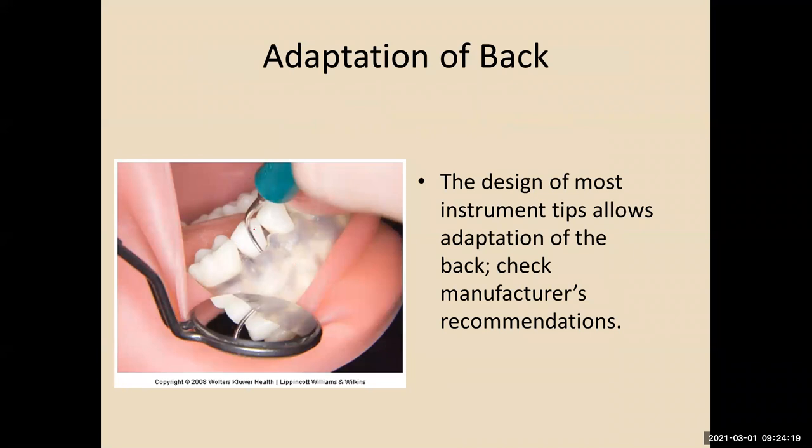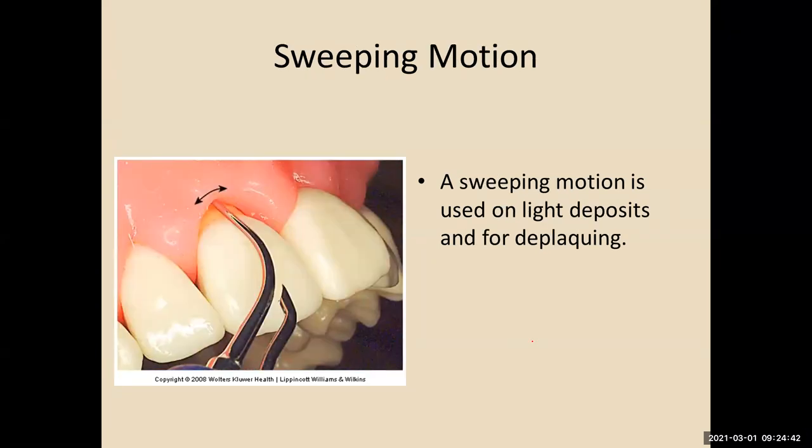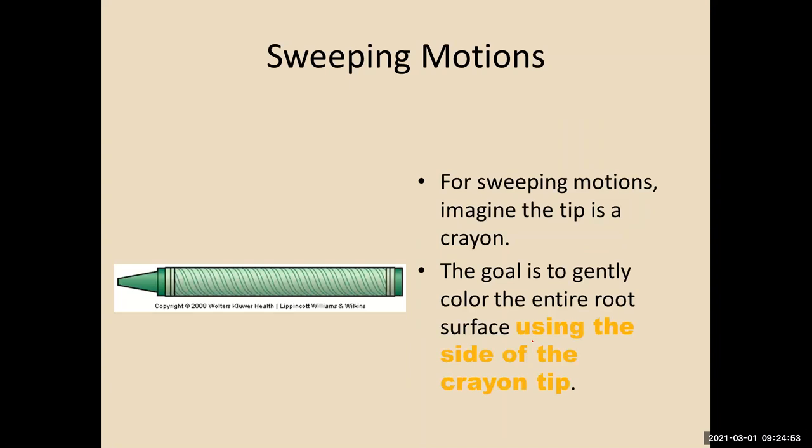This is using the back. You're starting at the top. For heavy calculus, you are tapping the calculus, using sweeping motions to deplaque and remove light deposits. Did you all have an opportunity to use the crayon? Yes. Okay.